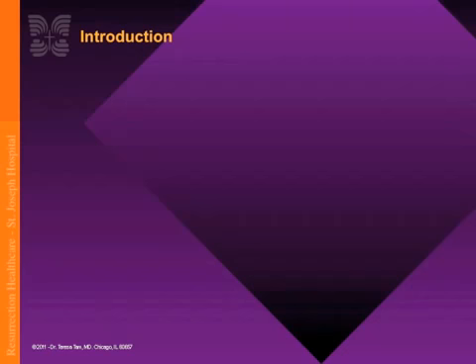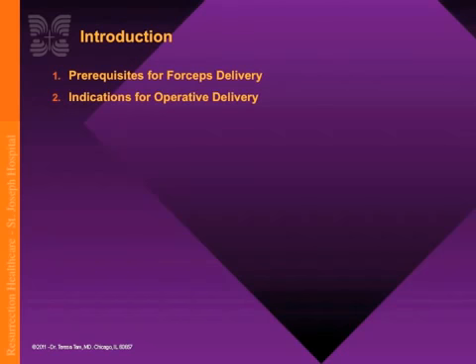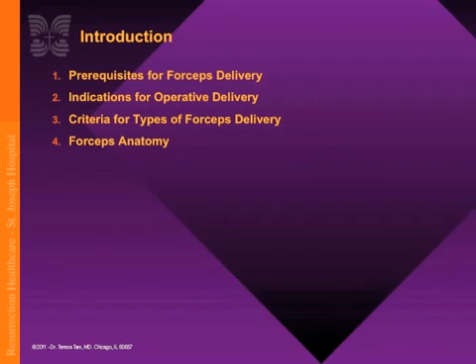This instructional video covers the requirements for forceps vaginal delivery, their indications for use, the ACOG criteria for types of forceps applications, the 4 main forceps parts, and a video of proper technique in classic forceps application and removal.